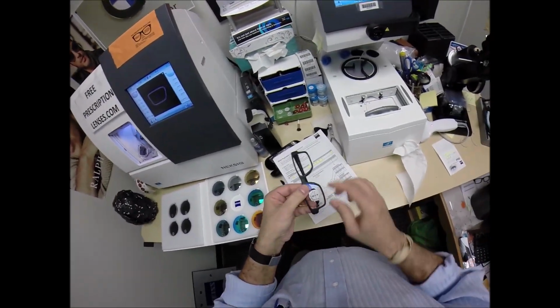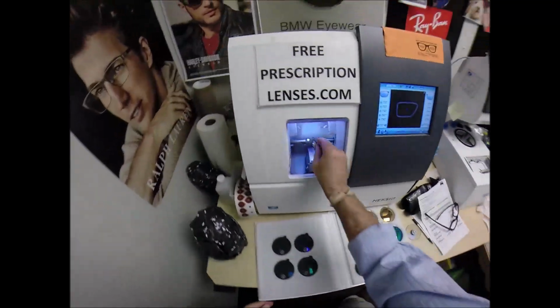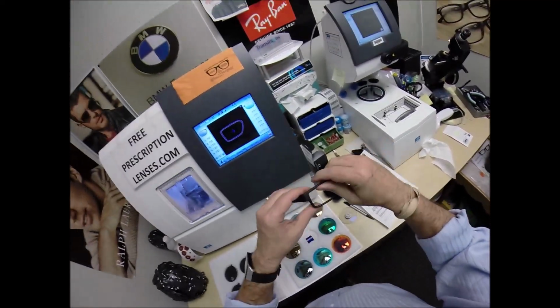Dry everything off. Tuck it in the outside corners. Push down the nose. No, it does not. So we're going to take another 1/10 of a millimeter off. The right lens always takes longer.